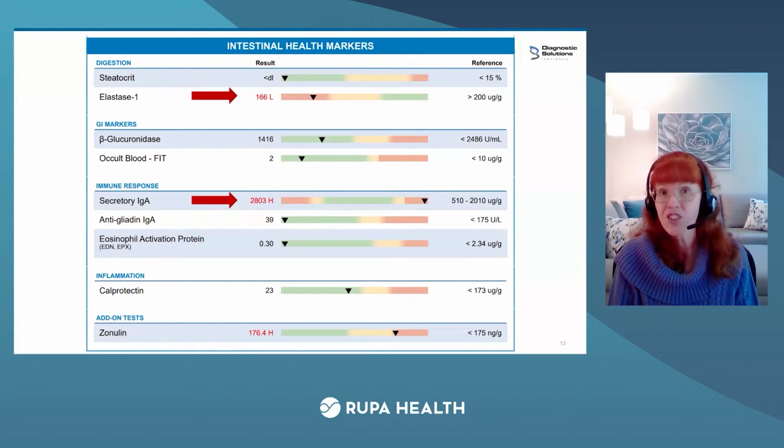There are 2 infections here, H. pylori and Dientamoeba fragilis. There's a high level of yeast. There's a high level of some nasty bacteria like Klebsiella. That immune system should recognize that things are not so good here. I need to be doing something.